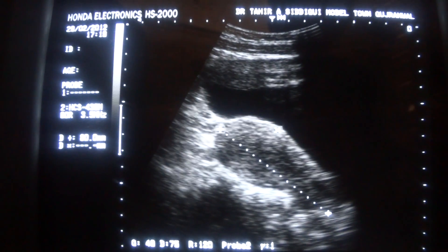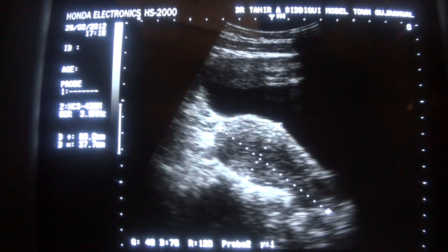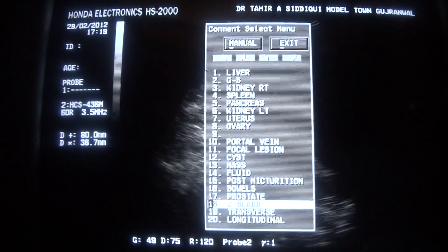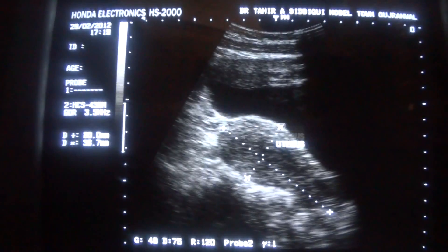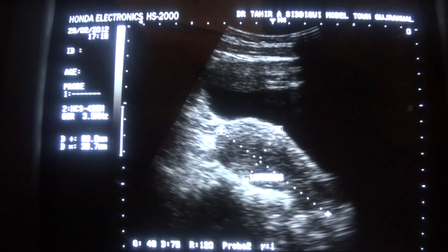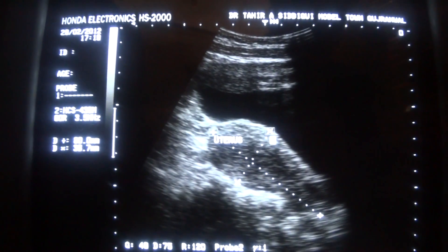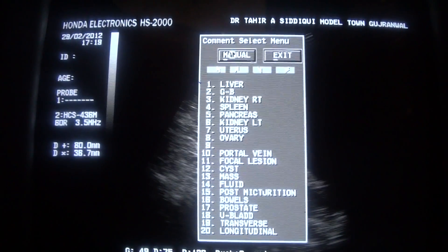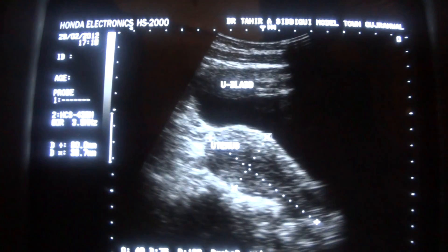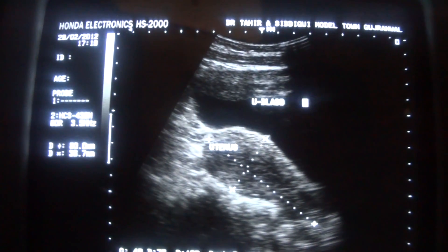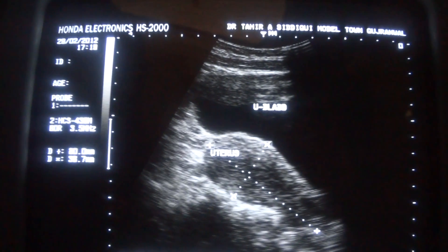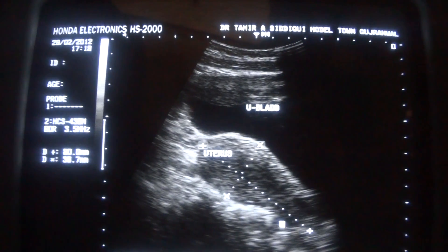The uterus measures 8.0 cm in length and 3.7 cm in width. This is the anterior segment of the uterus, this is the fundus, this is the posterior segment. This is the urinary bladder. This is the cervical region.